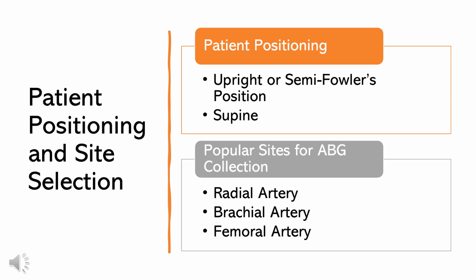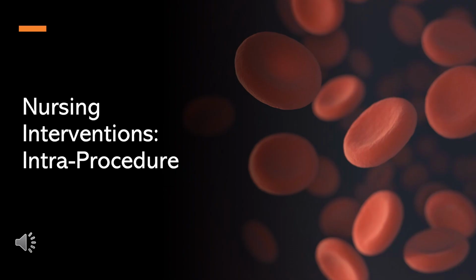Finally, before the healthcare provider begins, help in confirming the patient's comfort and make sure that final consent has been obtained. Your role in keeping the patient informed and at ease is pivotal. Nursing interventions intra procedure.